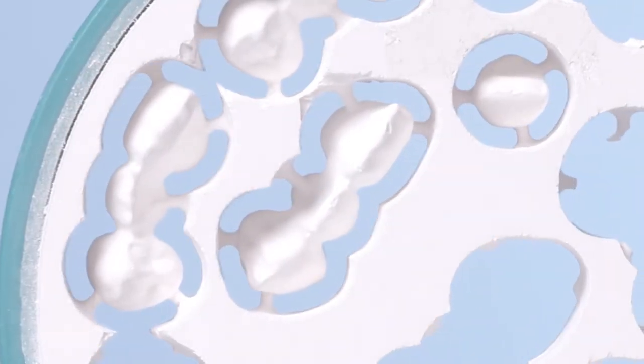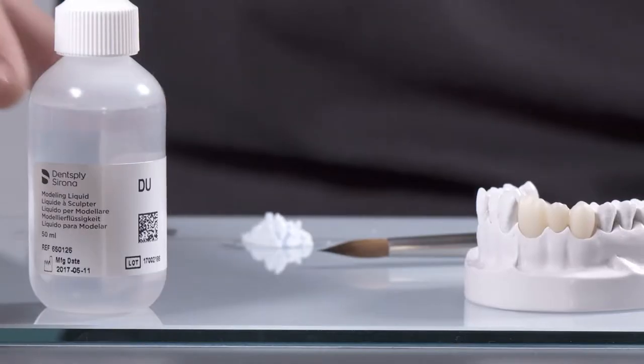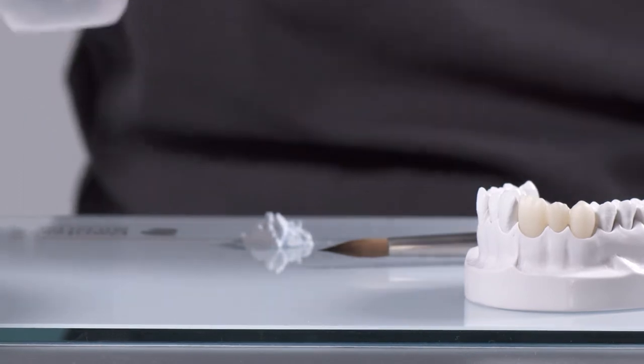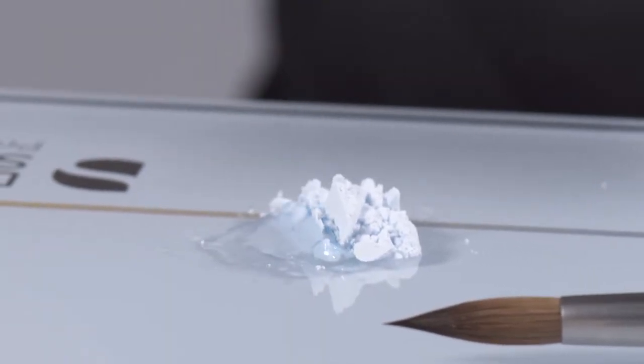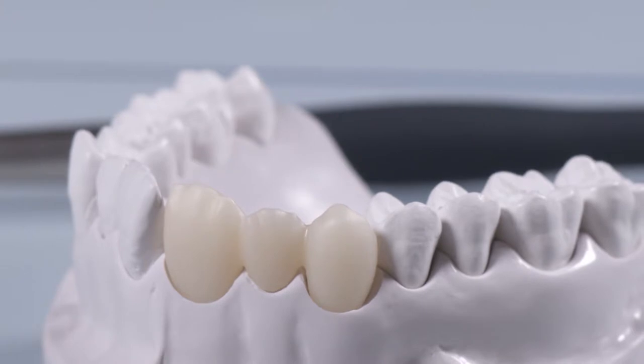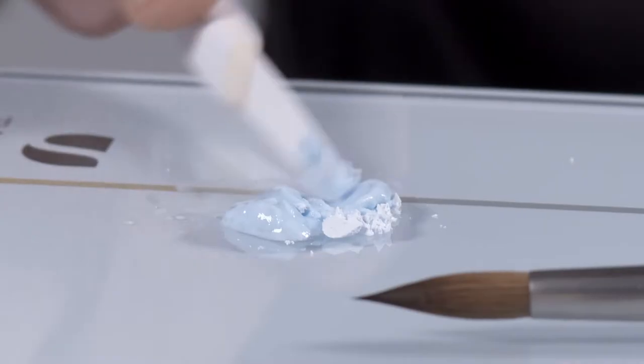The Cutback Technique and Circon XT offer an excellent opportunity to further improve aesthetics by applying only one incisal material, namely Seltra Ceram Enamel Incisal E1. The Mamelon structures were created when designing the framework.